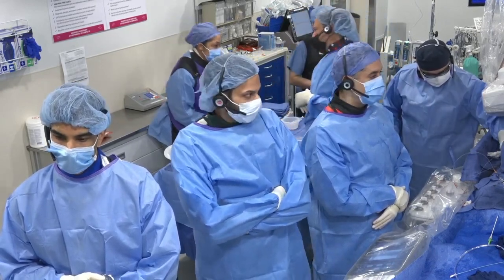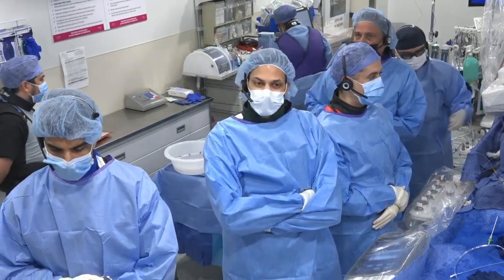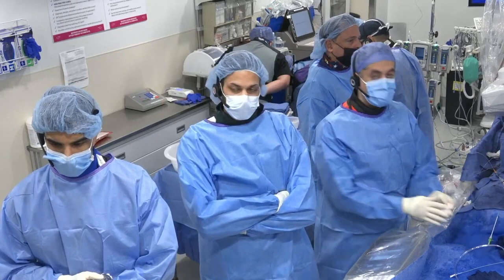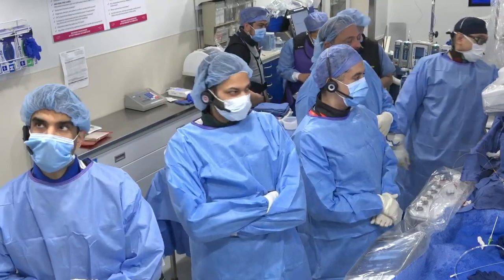And then as a surgeon, the other thing I always think about is surgery. But as we highlighted here, surgery is not a great option because she's already had that groin operated on. It's going to be extremely scarred in. It's going to be really hard to do an endarterectomy because sometimes you don't get that nice plane in a reoperative field. So I think an endovascular approach here is a good option.